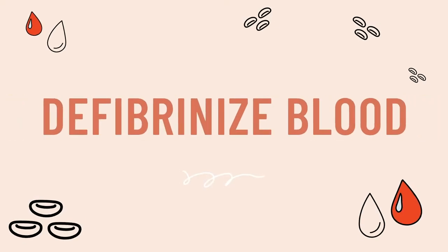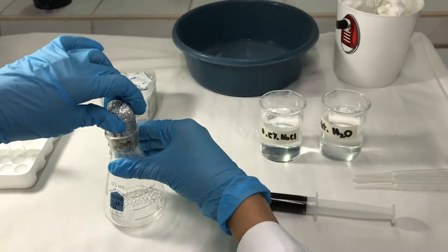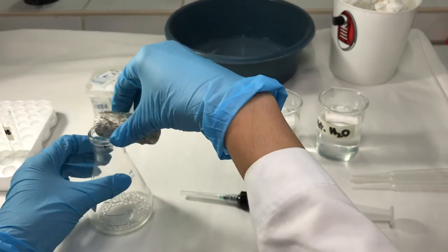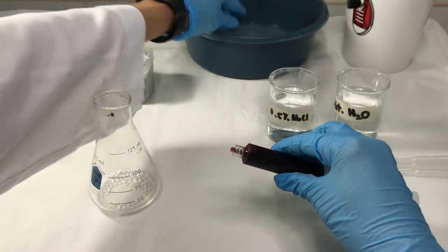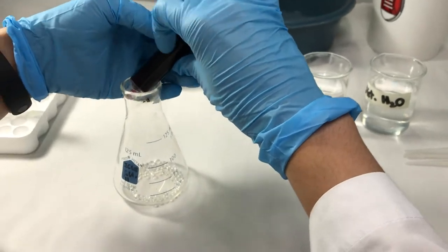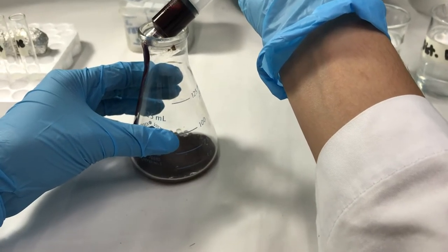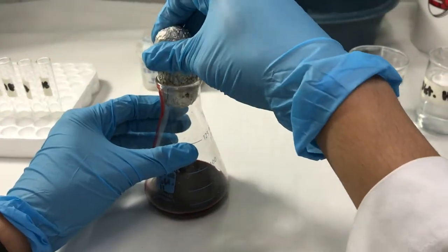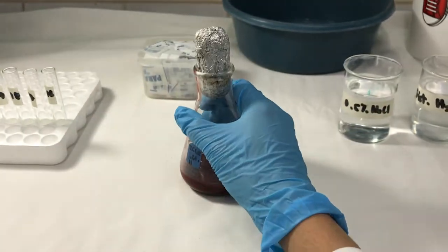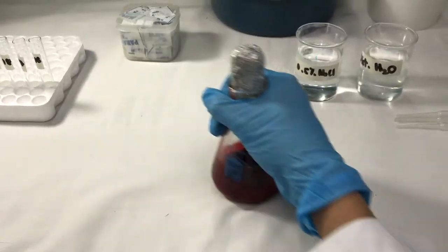The first thing you need to do is defibrinize your blood. For this procedure, you will need a flask with glass or silica beads. Use venous blood collected in a syringe. Gently place the blood into the flask by allowing it to flow down the sides. After, securely cover your flask and mix in a figure of 8 motion. Continue to do this until clots have formed around your glass beads. After, obtain an aliquot and place it in a glass tube.